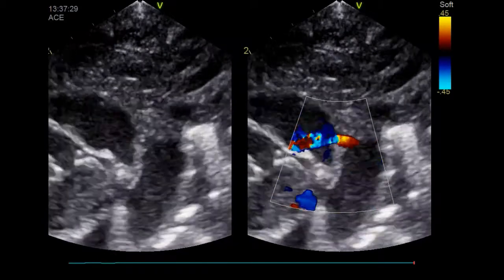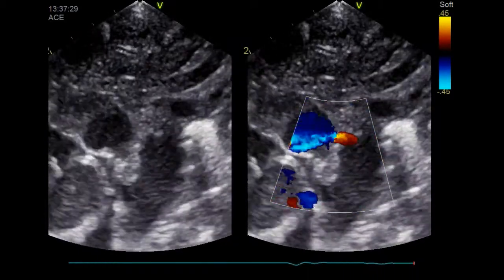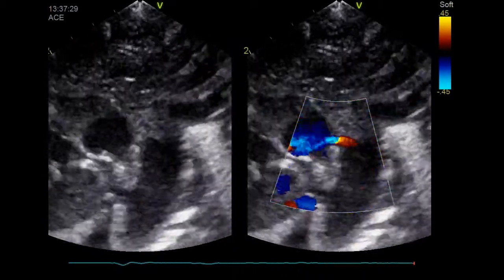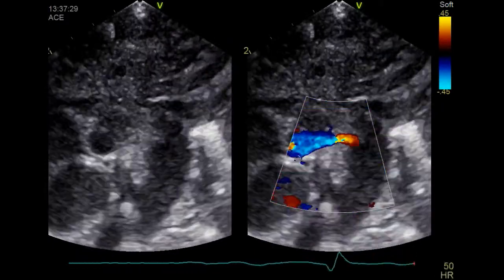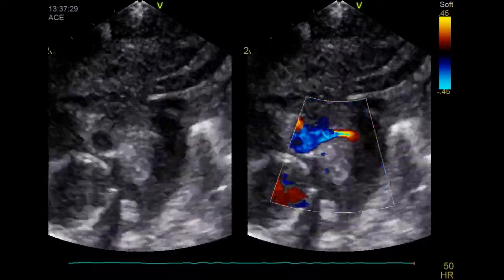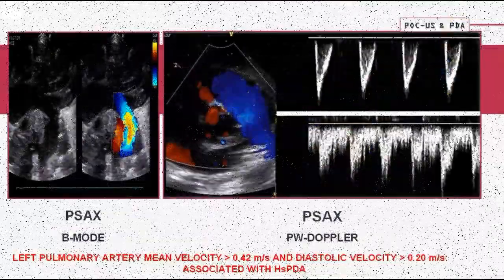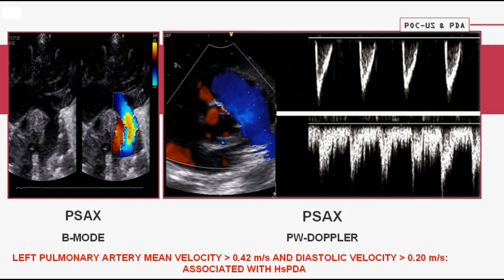Pulmonary hyperperfusion due to a hemodynamically significant PDA can be detected by interrogating the blood flow velocities of the left pulmonary artery, and can be used to define the hemodynamic impact of the ductus on the pulmonary circulation. Elevated mean and diastolic blood flow velocities in the left pulmonary artery should be taken into consideration when staging the hemodynamic impact of the PDA.